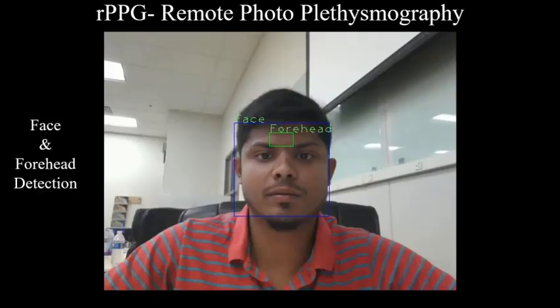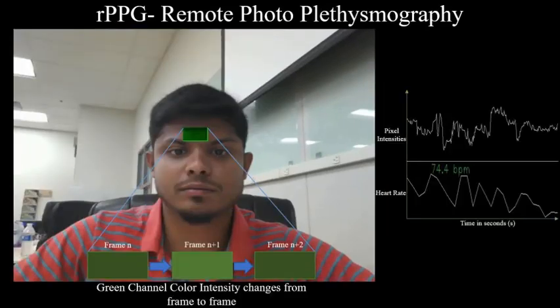Remote measurements of cardiac pulse can provide comfortable physiological assessment without electrodes, and the statement as such is the inception behind remote photo-plethysmography. Photo-plethysmography senses cardiovascular pulse wave through variations in transmitted or reflected light. Typically, the ambient light's green channel intensity difference is known to depict the change in blood volume flow based on cardiac pulse. Green channel intensity difference is then signal processed to detect the heart rate.